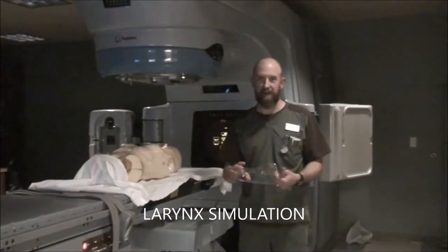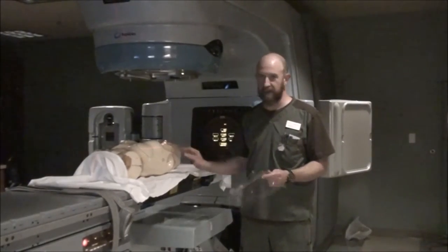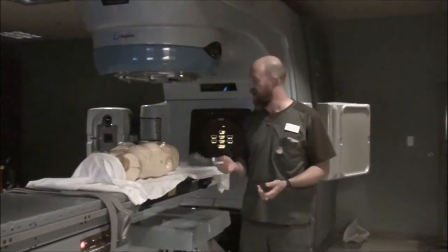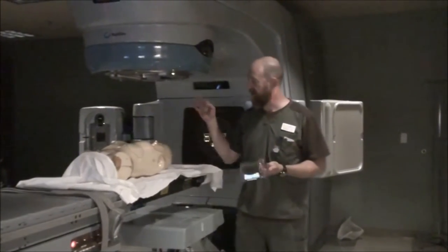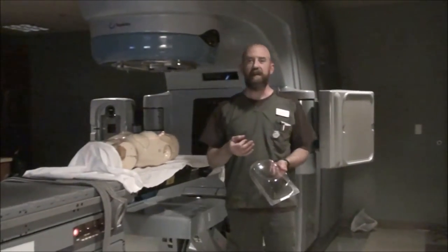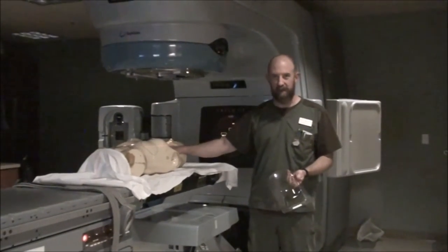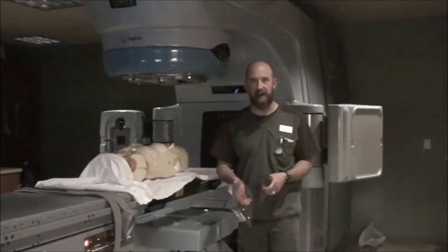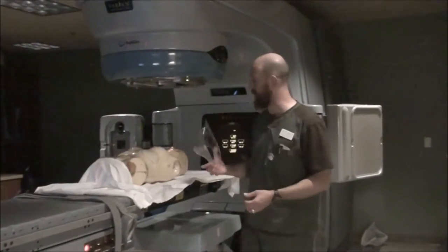This week we will cover larynx and electrons. The first simulation we'll do is for the laryngeal. If you're going to do a simple larynx simulation, it is usually going to be with just two laterals. You want to make sure that you have the neck hyperextended — a C headrest or better is what you need.